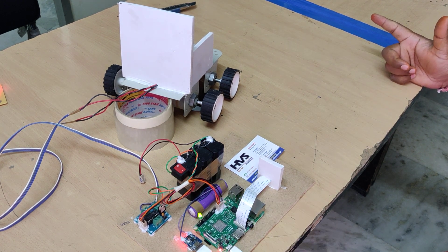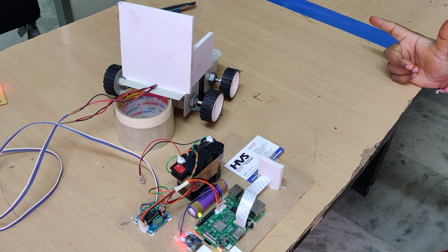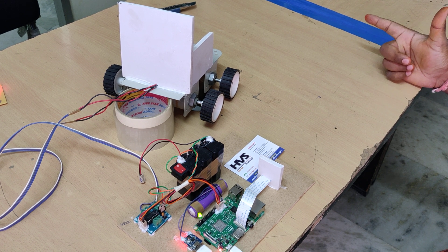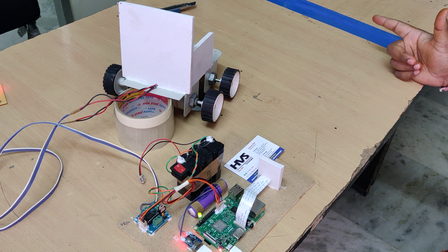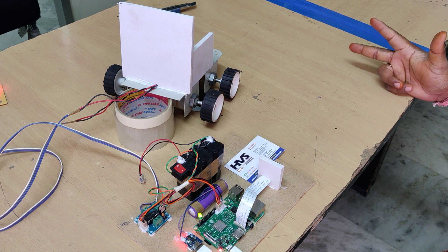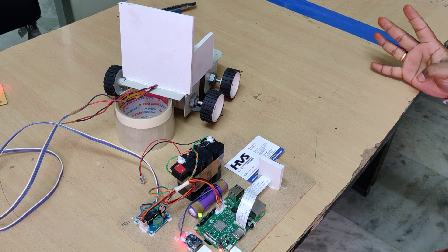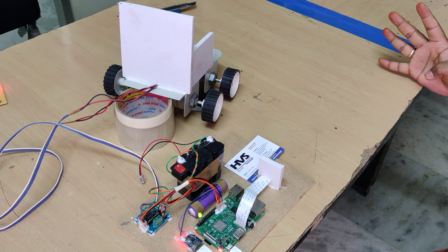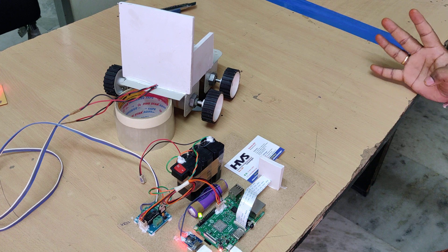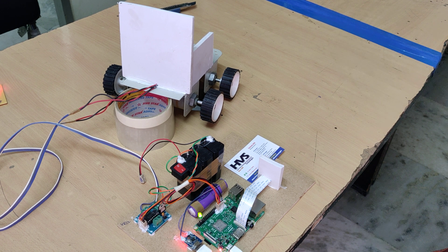This is the main switch. Showing three fingers — the wheelchair moves forward. Showing four fingers — it turns. And five fingers — off.